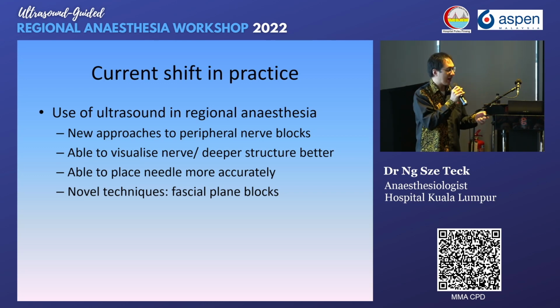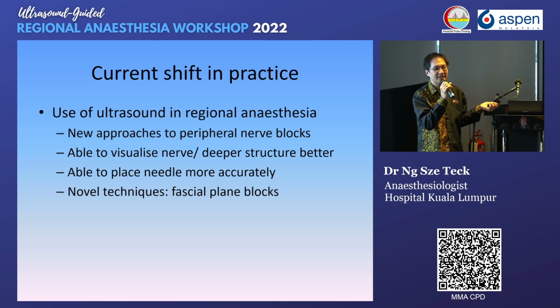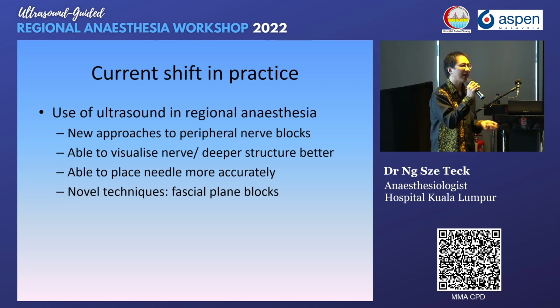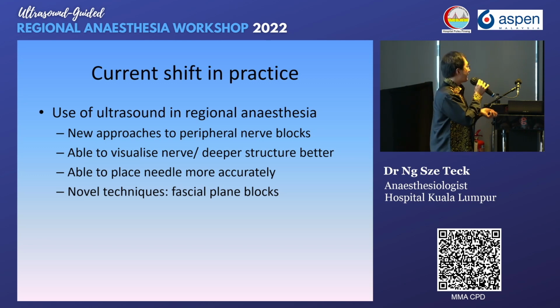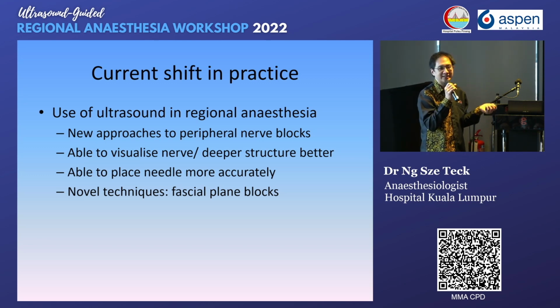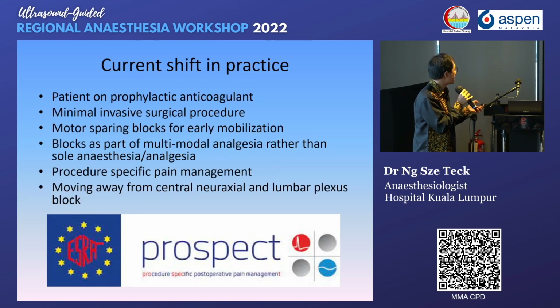With the use of ultrasound, blocks can be safer and faster. And there are newer blocks being introduced all the time. And the role of blocks is not just for anesthesia or analgesia. It can be part of a multimodal analgesia.